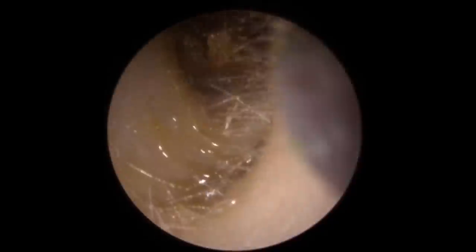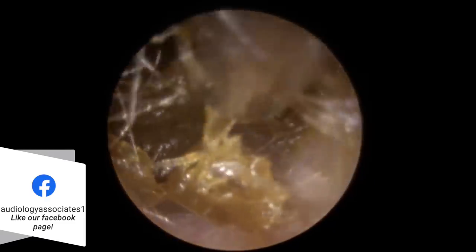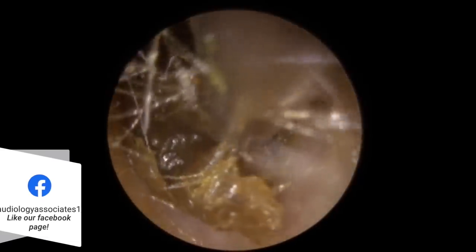You can see a little bit of dry skin there getting sucked into the machine — that kind of top skin layer of the canal wall. Just going back in now, lifting the edge, just trying to pull it into the suction tube, getting a little bit of a grip on it. It's just starting to suck the smaller softer bits inside the machine. Just letting you know there won't be any videos next week because I'm on leave — taking some time off with the family — but they'll resume back to normal the week after.